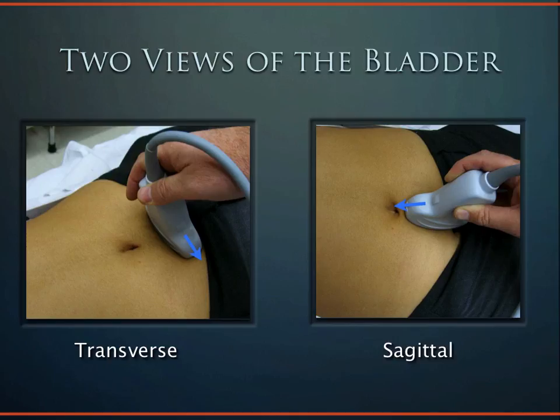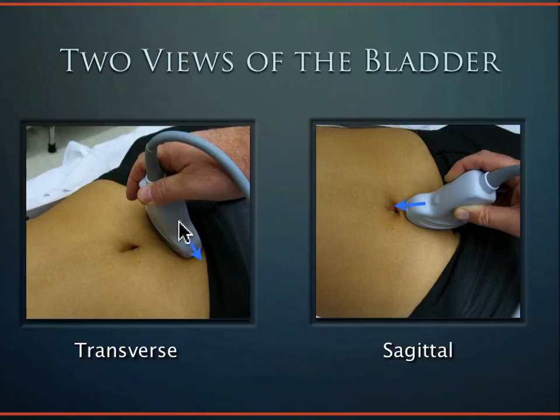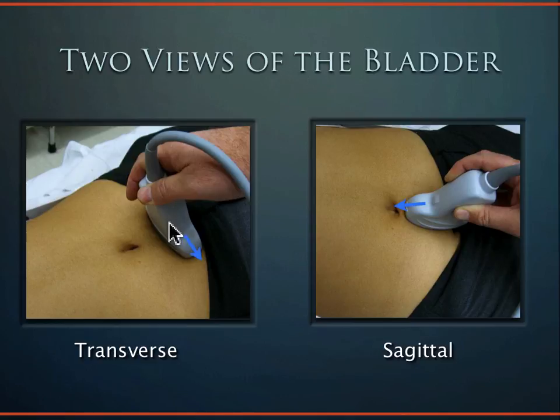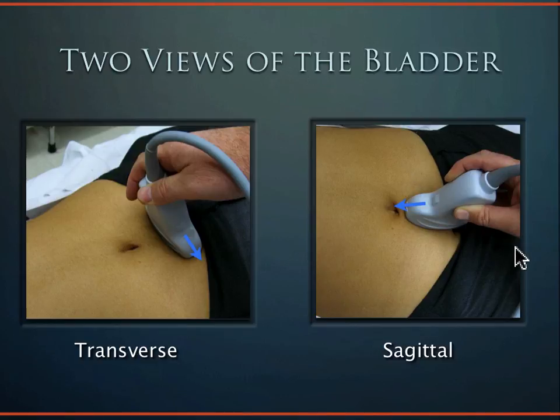There are two views of the bladder: transverse with indicator to the patient's right, and sagittal with indicator to the patient's head. The probe sits just below the umbilicus, but since the bladder is actually down by the pubic symphysis, you tilt the probe inferiorly — sending sound down toward where the bladder really is. In the sagittal view you similarly rotate the cable to shine sound inferiorly. The probe can be held quite flat to visualize the bladder.